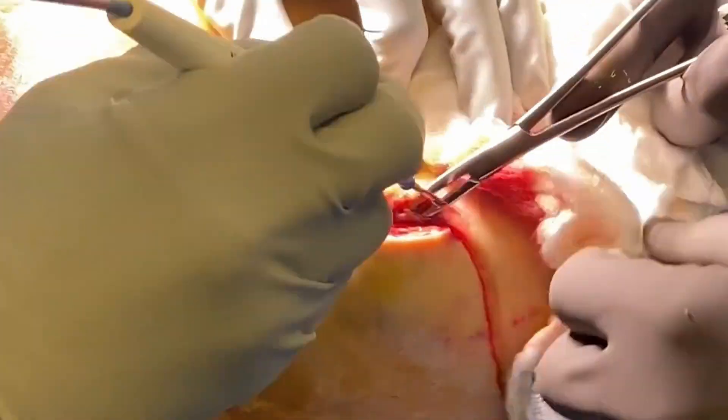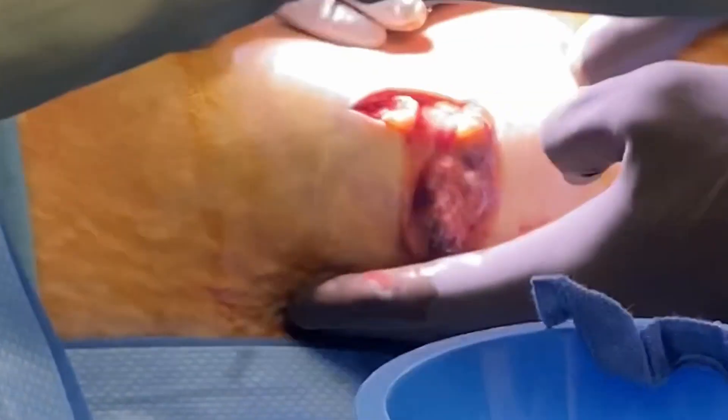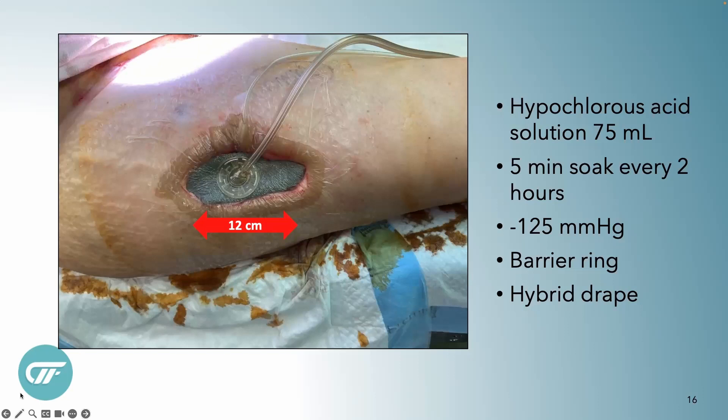We make a small incision in the skin — her skin was pretty and healthy — and then we excise all the necrotic tissue by just taking it out using suction, without having to make a huge wound for this patient. Then we put the gray foam with holes in it deep into the wound bed, with the instill port inside sitting way up underneath. The fluid comes down the tubing into the wound itself, and the negative pressure port is back here. The incision is only 12 centimeters long, but the wound is huge underneath.